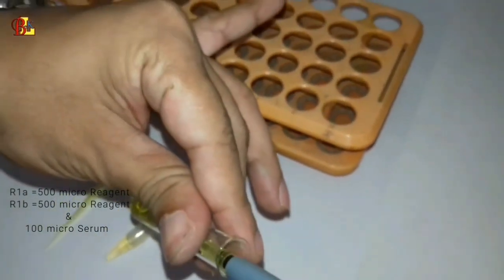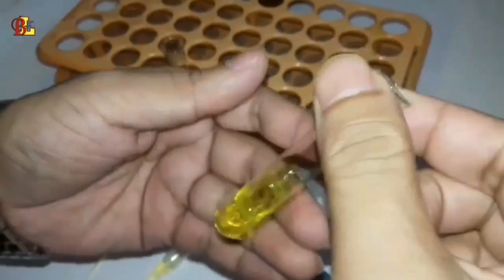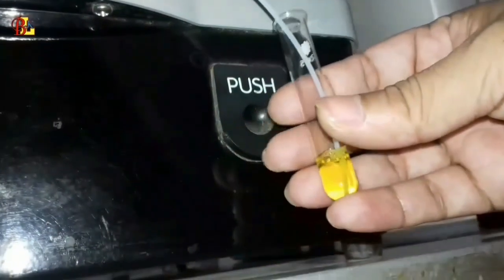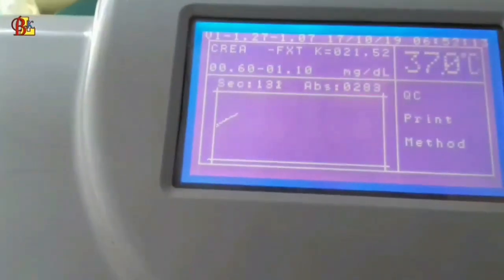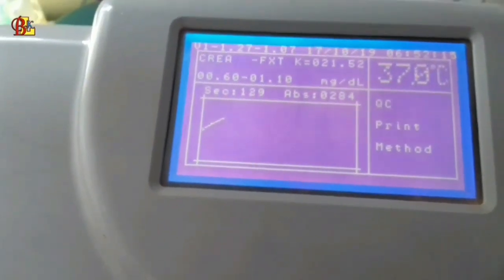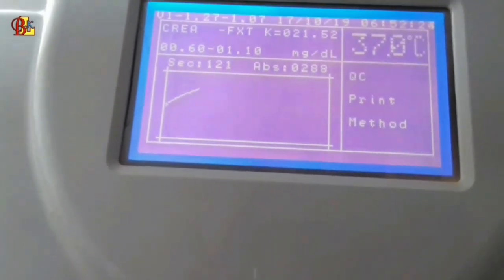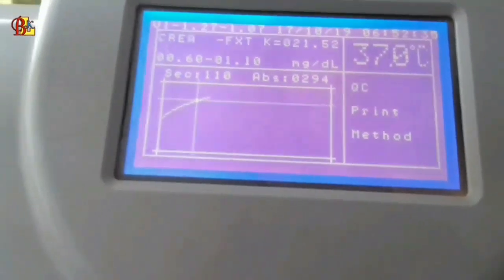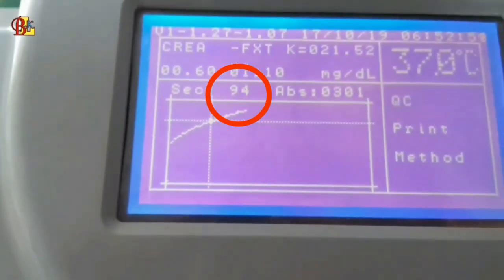Now we will mix the serum in the test tube and run it on the analyzer. After the sample run, we will go to the analyzer screen.